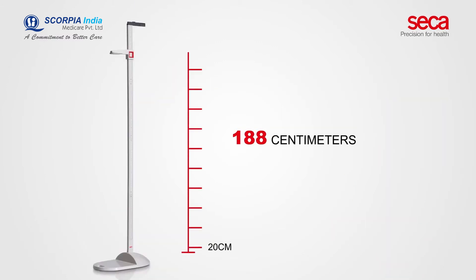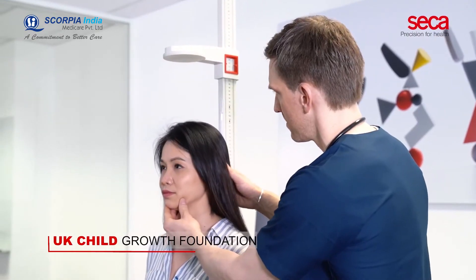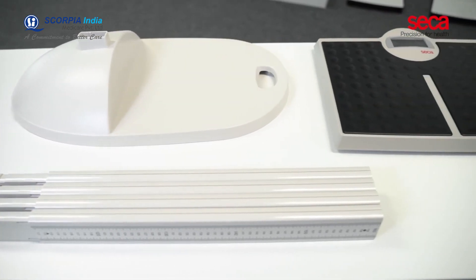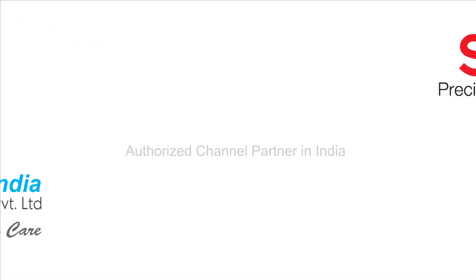The CECA 213 measures from 20 to 205 cm and is approved by the UK Child Growth Foundation. The CECA 813 and CECA 213 fit perfectly into the CECA 414 carrying case, made from water-resistant material.